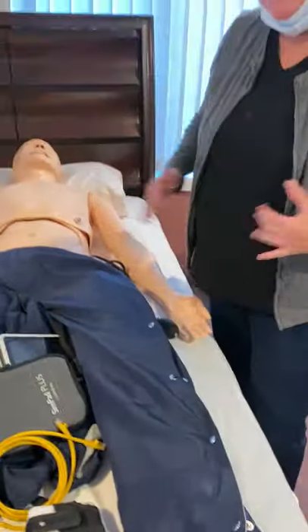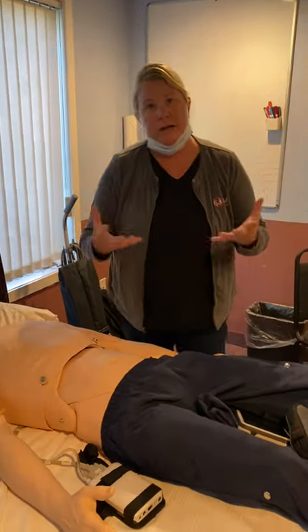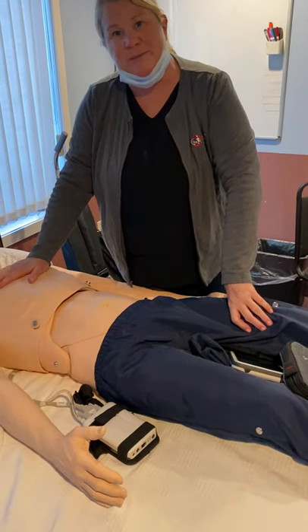That is an overview of his functionality and the SimPad. I'm going to send more details and documentation so you can have it as a reference, and hopefully you'll have a great experience using him and all of his features. Thank you.